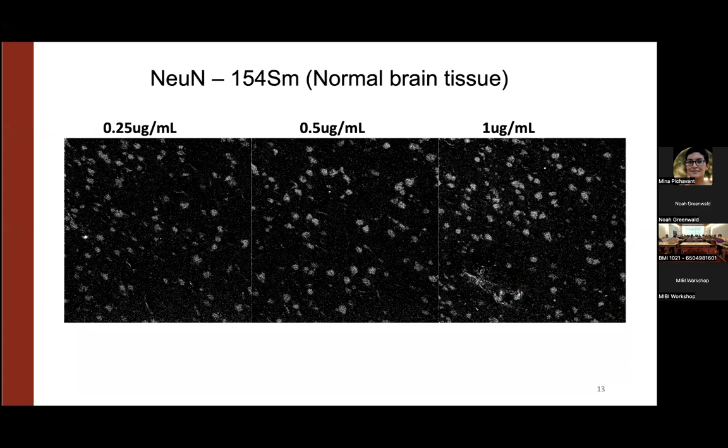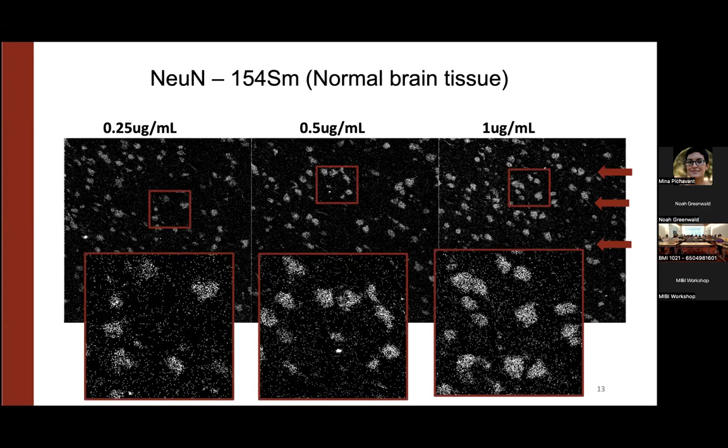So starting with some of the antibodies we were validating for the glial tumor project. This one was the easy one. This is NeuN. NeuN marks neurons in the brain. And as you can see here, it's a very distinct morphology that you see. They're not circular, they're this sort of weird pattern of staining. And on top of that, you can almost see axons in neurons, I'm not sure if you can see that, or these projections, or a single tube coming out of the cell. So you have this very distinct pattern that you're looking for to easily validate this marker.